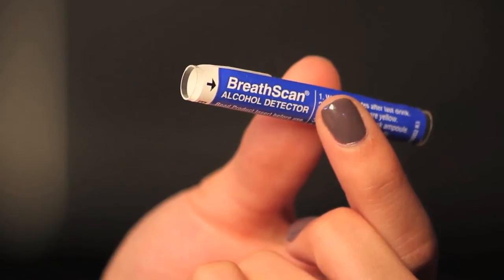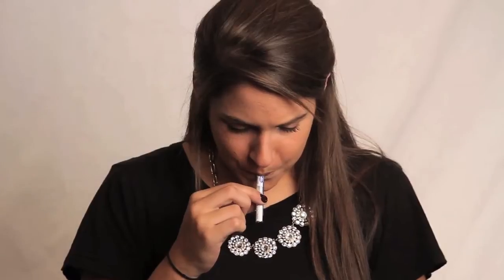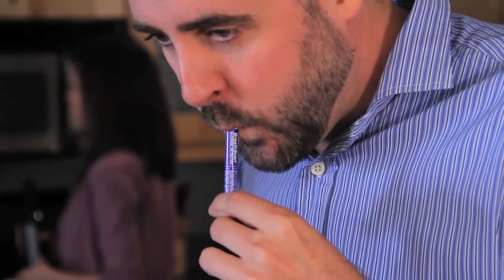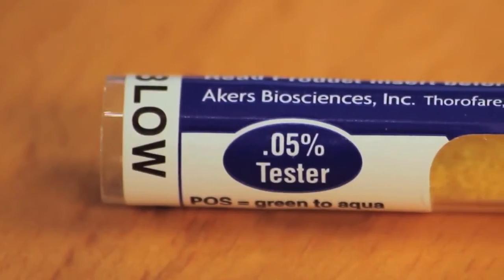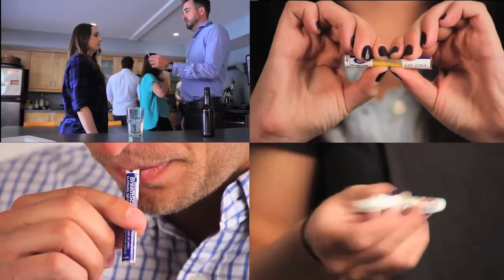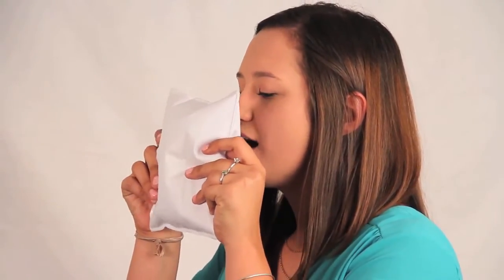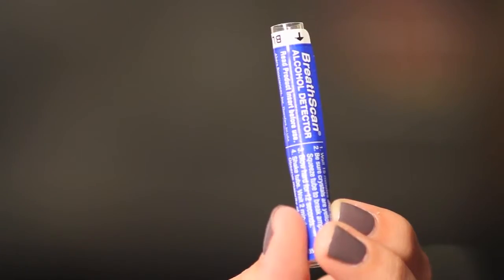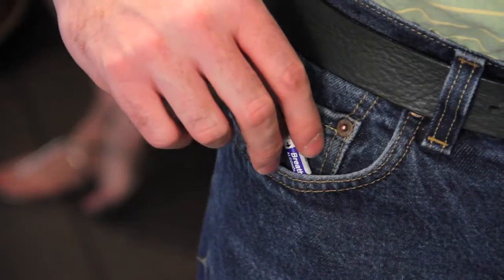The Acres Bio BreathScan alcohol detector is a fast, easy, and portable way to detect the presence of alcohol in an individual's breath. It takes just two minutes to achieve a result and can be completed in four simple steps. Unlike other disposable alcohol detectors, the BreathScan doesn't require clumsy and embarrassing blow bags — all you need is the small detector tube that fits easily in pockets and purses.